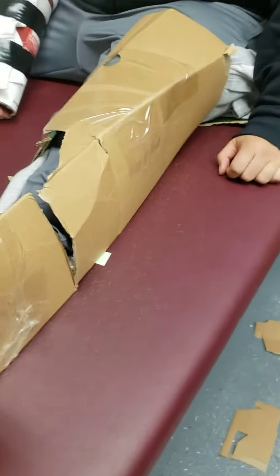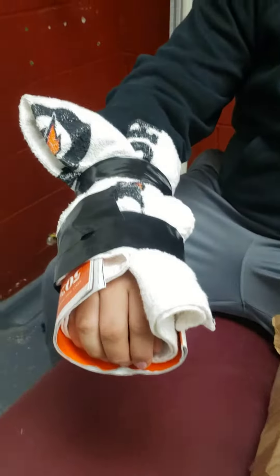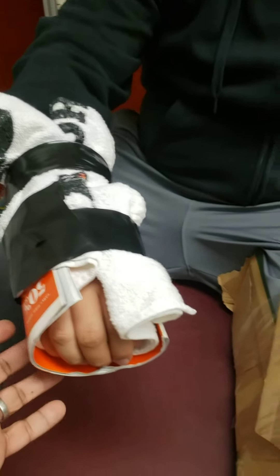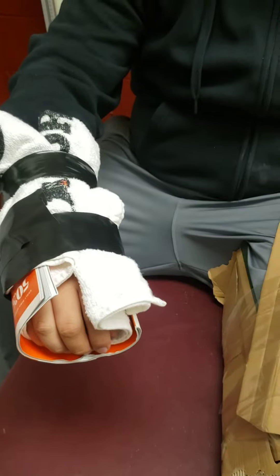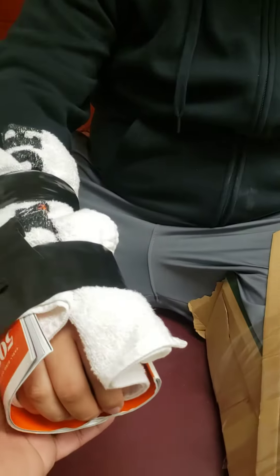So these are basically the splints I made from the stuff I showed you a second ago. Over here you have the magazine with the towel underneath — between the skin and the splint — and I used some duct tape just to keep it together. Obviously if it was a forearm I would use something bigger like a bigger cardboard box, but this is only for a wrist.